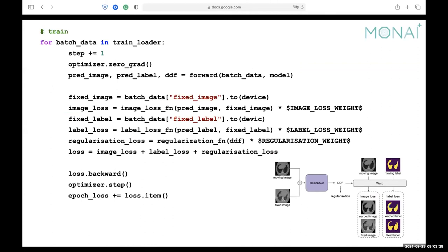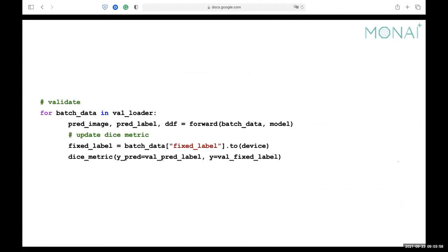During training, for each step we get those three components from the forward function, and use them to calculate the image loss, label loss, and regularization loss. By summing all those losses and doing backpropagation, the network learns in the correct direction. During validation, instead of loss we calculate the Dice metric, using the mean Dice metric also implemented in MONAI.